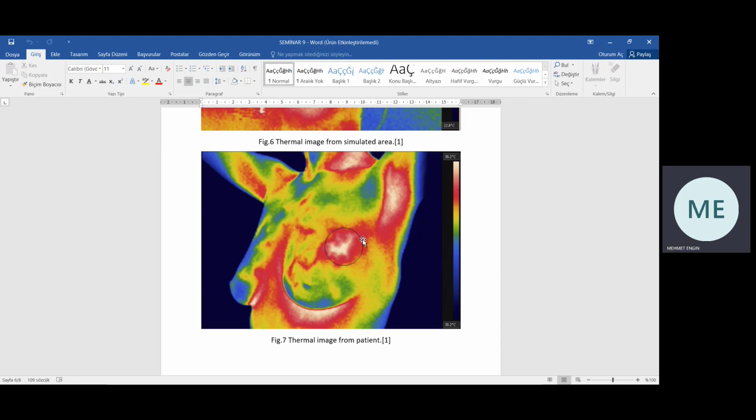According to information from mammary gland simulators for imaging applications, there is no specific simulator for thermography yet. There are simulators with thermal properties, but they are used for thermoacoustic imaging, which is not based on the same operating principle as thermography. Also, the thermal properties of those models are focused on the type of dielectric material used and not on the control algorithm. It is important to notice that, so far, there is no simulator with features comparable to the ones presented in this article.